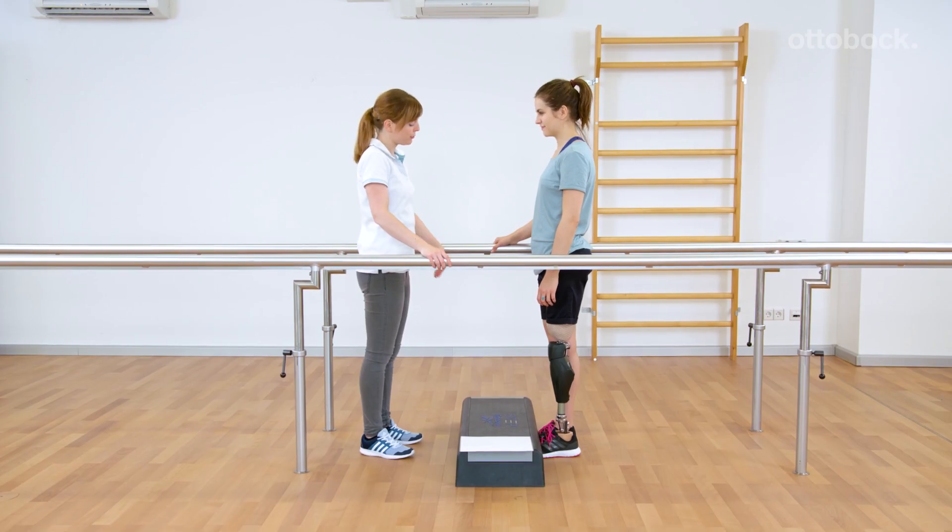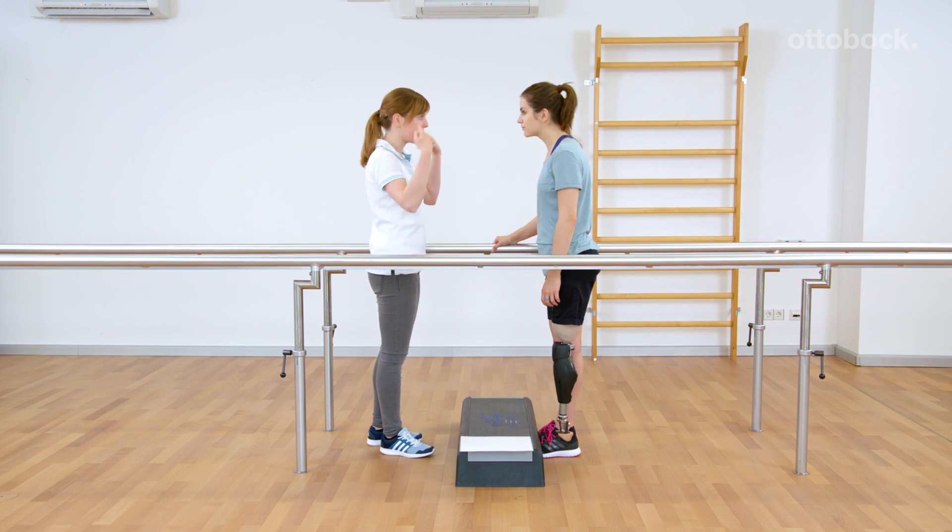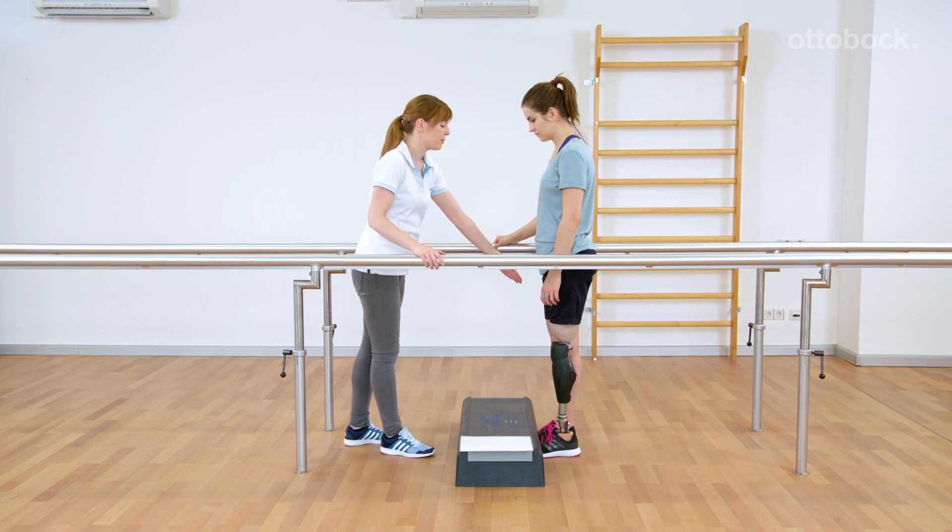A certain movement pattern is necessary to trigger the stairs and obstacle function. At first, this pattern is trained with the contralateral leg. An open step is ideal for this training.